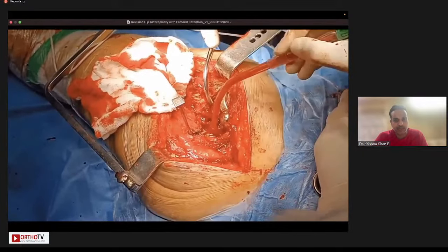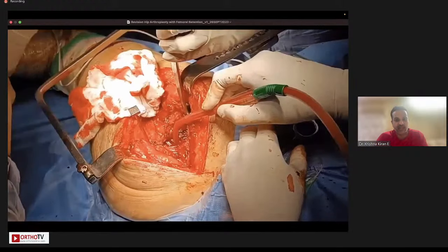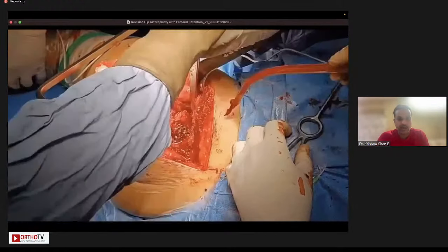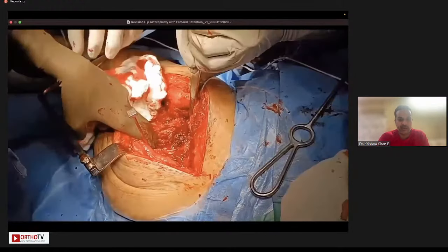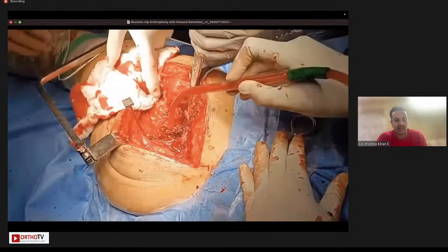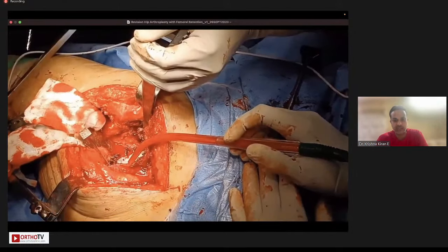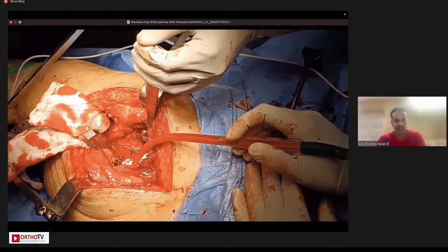And now I position my anterior retractor into the anterior column in the direction of the anterior superior iliac spine, but not in the direction of the anterior wall. Once you do that, now you have a 360 degrees exposure of the acetabulum. And this allows us to make our surgical procedures.